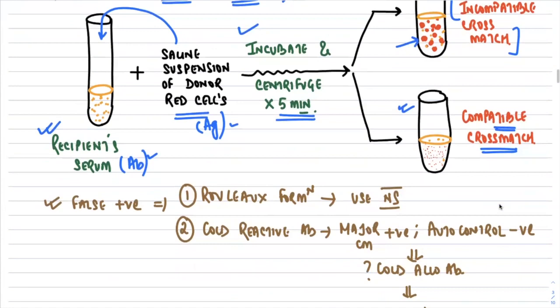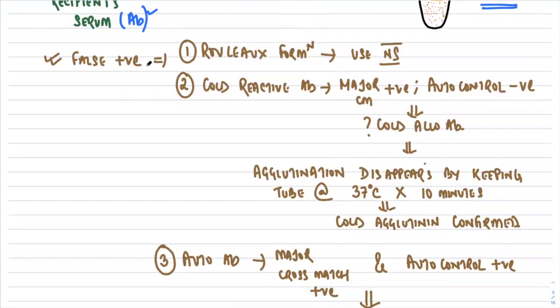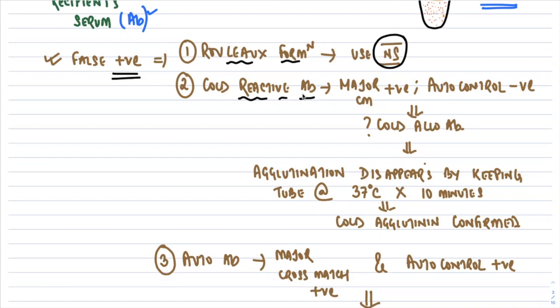There are conditions where the cross-match can give a false positive — agglutination that is actually false. The first is rouleaux formation: in conditions like multiple myeloma, excess plasma proteins cause rouleaux that mimics agglutination. Adding normal saline will dissolve rouleaux but not true agglutination. If the cross-match becomes negative after adding saline, rouleaux formation is confirmed.